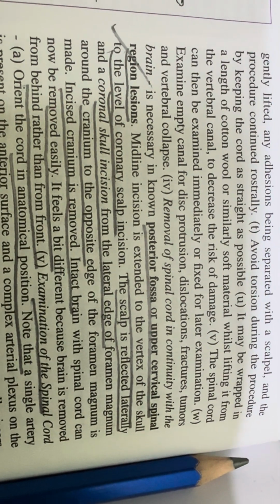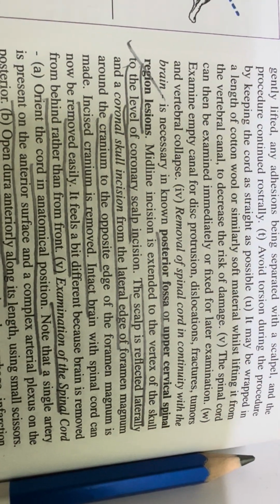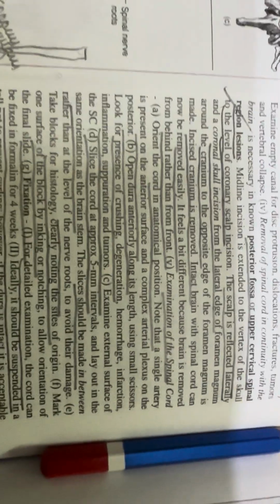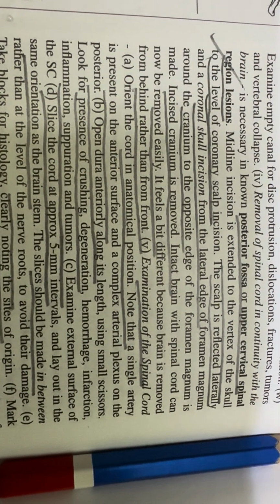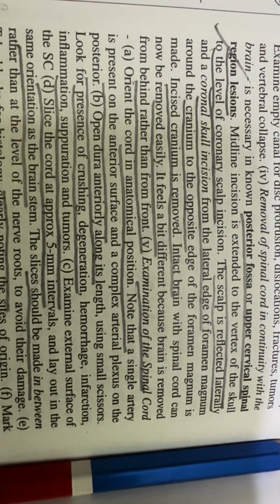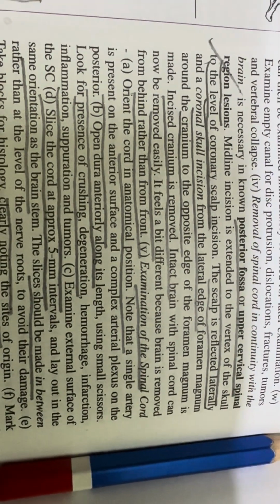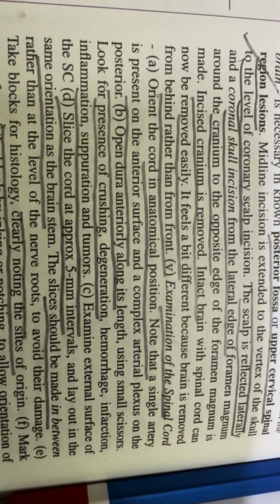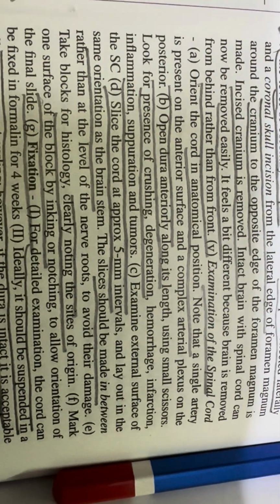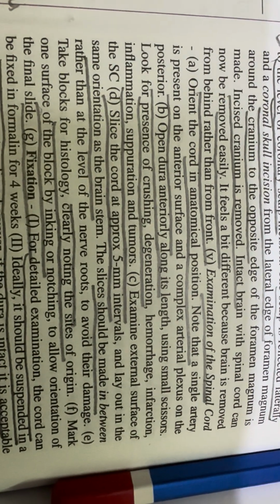The midline scalp incision is extended to the vertex of the skull to the level of the coronal incision. The scalp is reflected laterally, and a coronal skull incision from the lateral edge of the foramen magnum around the cranium to the opposite edge of the foramen magnum is made. The incised cranium is removed. The intact brain with the spinal cord can be removed easily. It feels a bit different because the brain is removed from behind rather than the front.